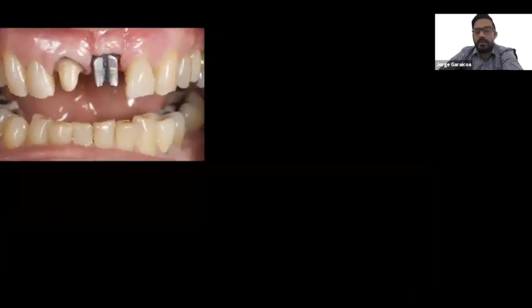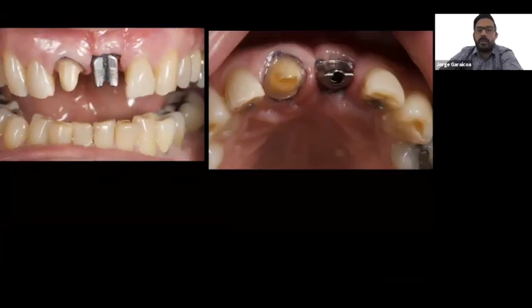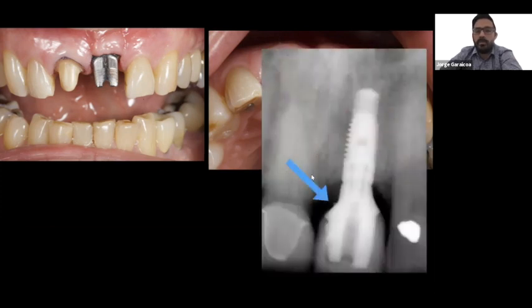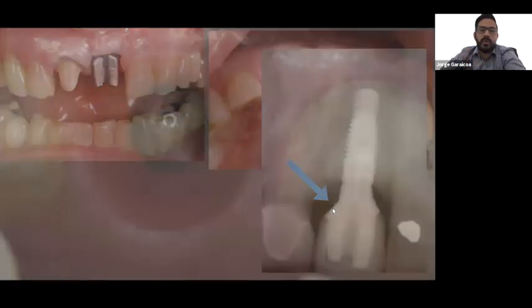Okay. So the other thing too is, sometimes even with cord, you have to be careful of the cement. This is another student case where we're trying to deliver the 2 crowns. So you can see that even with the cord in place, cement can flow underneath. It really depends on the amount of the cement that you use on that crown.